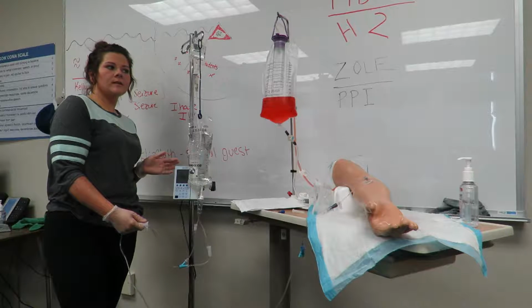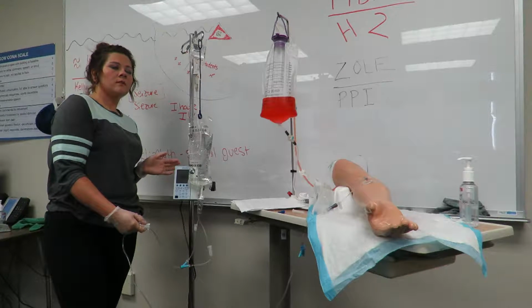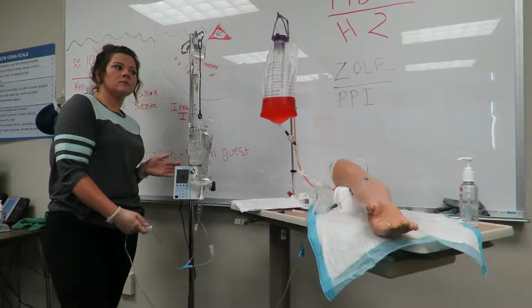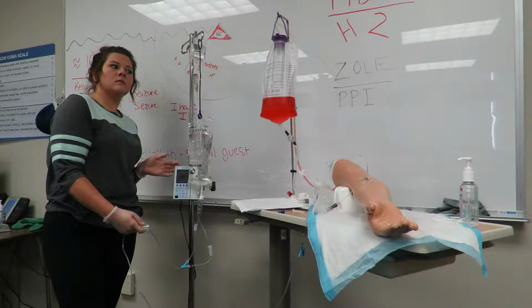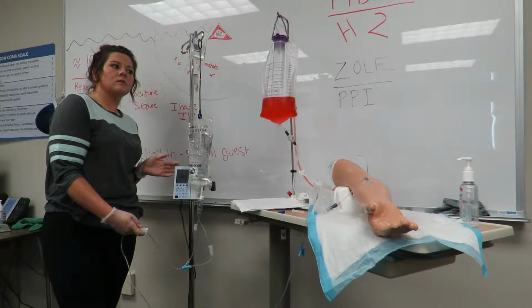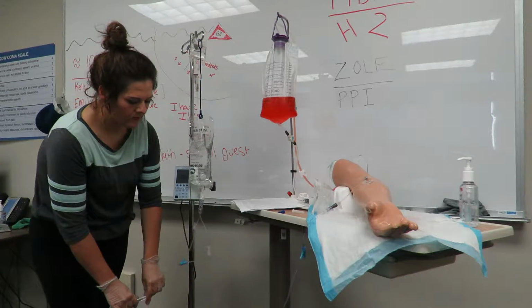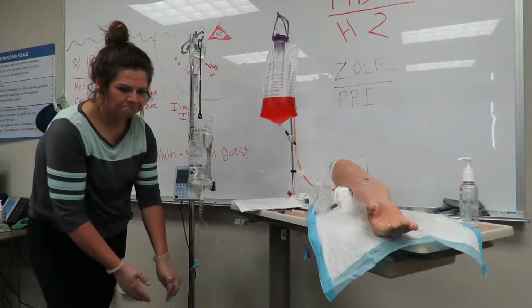I'm going to speed that up a little bit. Fast. Alright, and then that looks good. So that should be about 12.5 drops per minute.